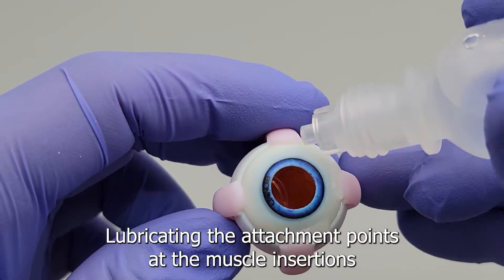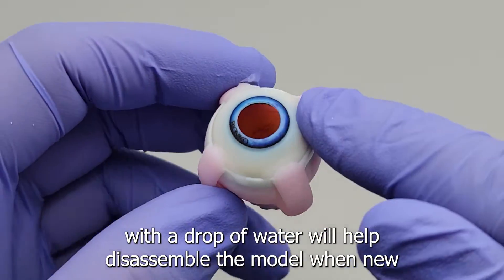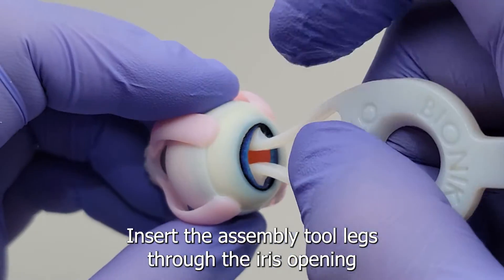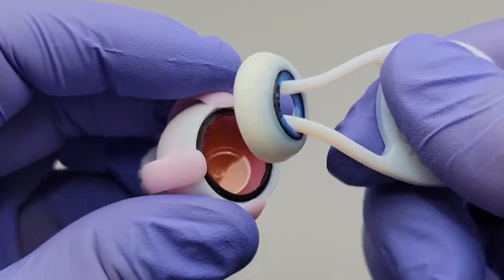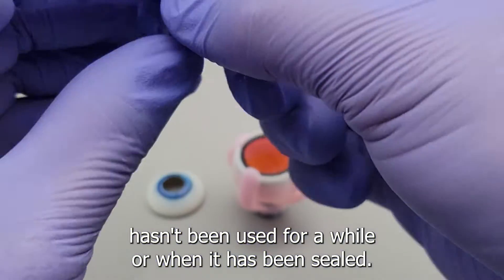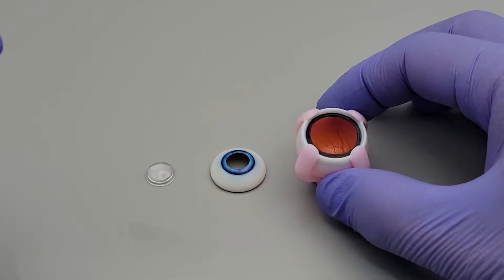Lubricating the attachment points at the muscle insertions with a drop of water will help disassemble the model when new or when you haven't used it for a while. Insert the assembly tool legs through the iris opening to help leverage the anterior segment from under each muscle insertion. This method of disassembly is only needed when the eye is new, hasn't been used for a while, or when it has been sealed.